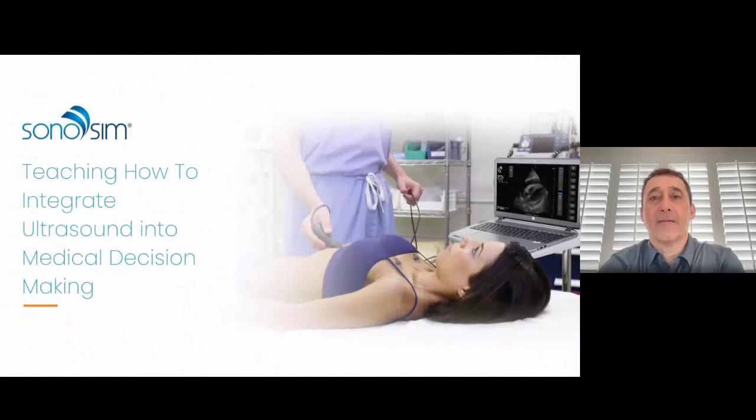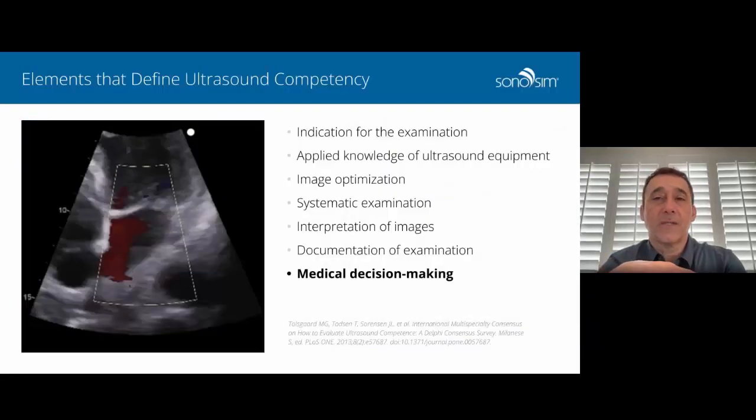Great, thanks for the invite, and very excited to be here with everyone today. Just to talk a little bit about our latest advances at SonoSim. We've been receiving a lot of feedback over the last several years in terms of how we can improve SonoSim LiveScan and Case Builder to really achieve its ultimate goal, which is helping instructors and learners, once they've acquired the ability to obtain and interpret an ultrasound image, make a clinical decision with that. The purpose of SonoSim LiveScan with Case Builder has always been to teach people how to integrate ultrasound findings into medical decision making. And what we're going to do today is discuss some of the advances that we've made that will help facilitate that process.